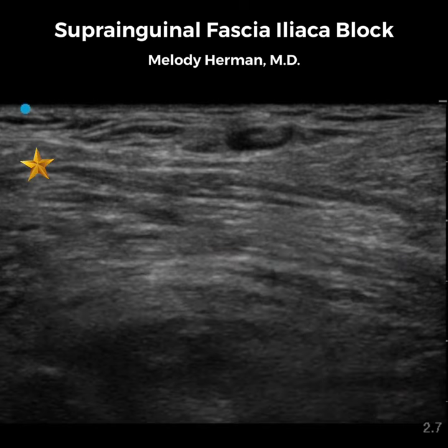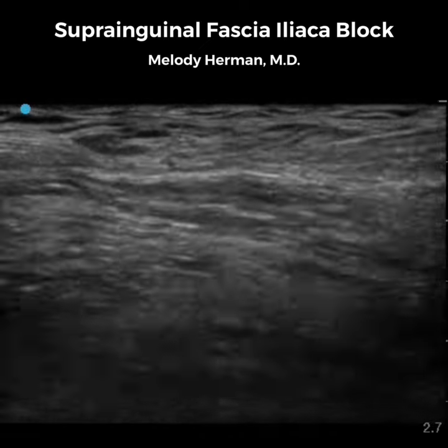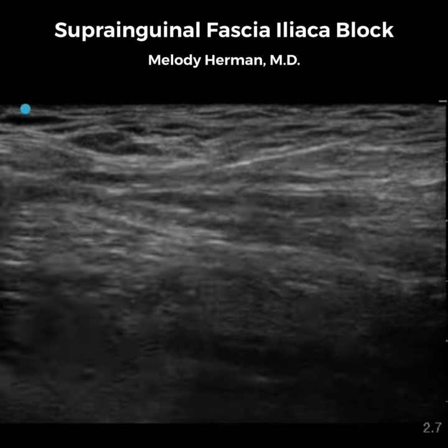If we aim for the fascial plane between iliacus and internal oblique on our first pass, our first injection is likely to be intramuscular. For this reason, I'll usually aim for the peak of the iliacus muscle or the fascial plane between iliacus and sartorius and hydrodissect my way up. The fascial plane begins to unzip when we test with saline.